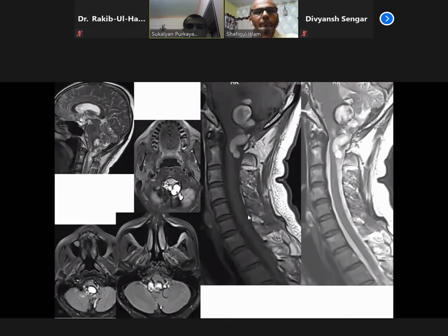Now you have to explain to the patient that just after the embolization, maybe for the first couple of days, the patient can deteriorate, and you have to keep these patients additionally on some steroid, at least for 3 weeks, and then the patient will improve. Because immediately what we're doing is blocking the whole thing with a solid thrombus. So obviously the compression will increase and he will deteriorate, but eventually he will improve. So this is the post.